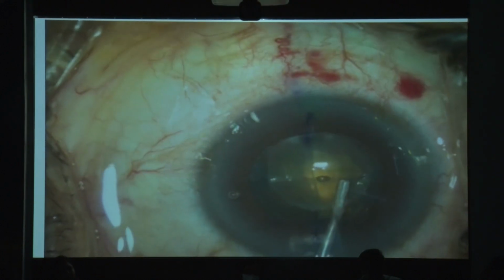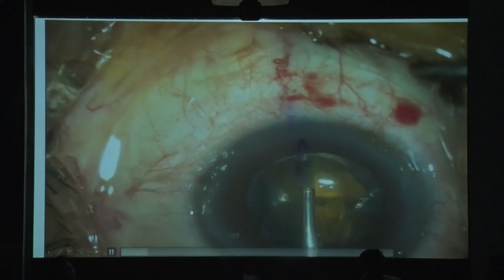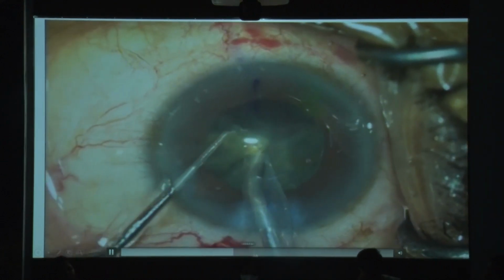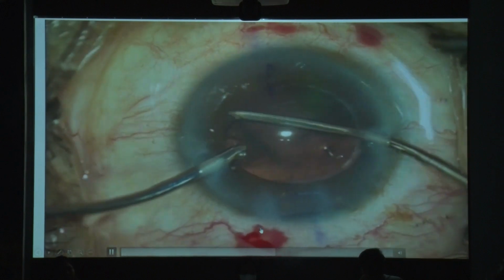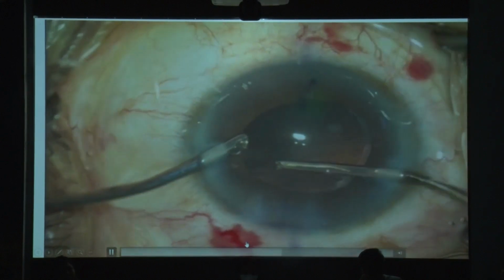I can remark it just for the sake of checking it, and at the end of the surgery I can align it, I can put a bit of ink mark also on that, and if you don't want, you may not put it.